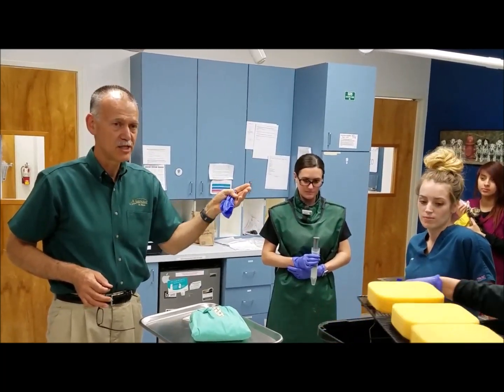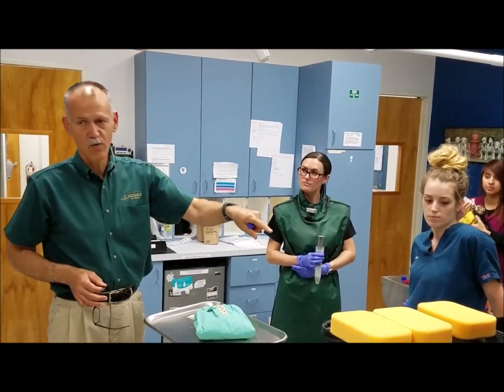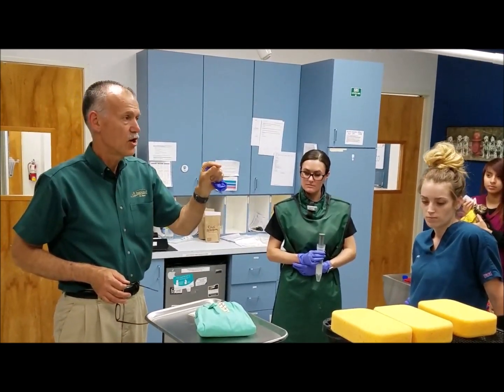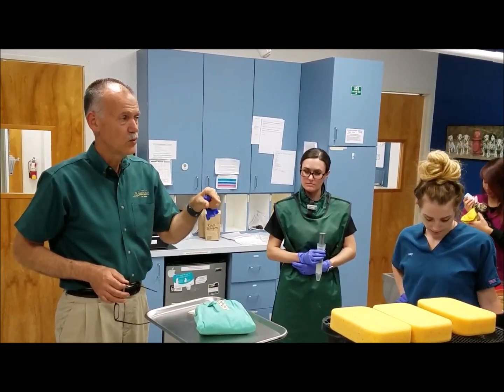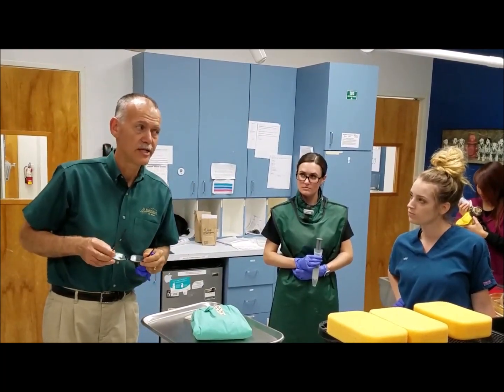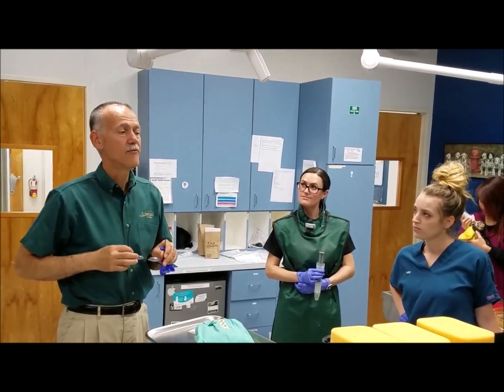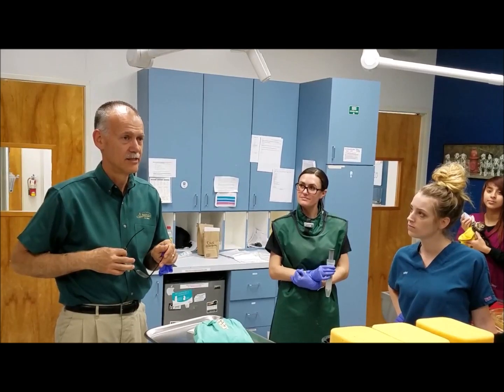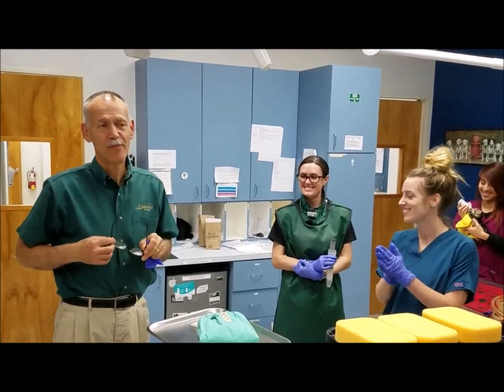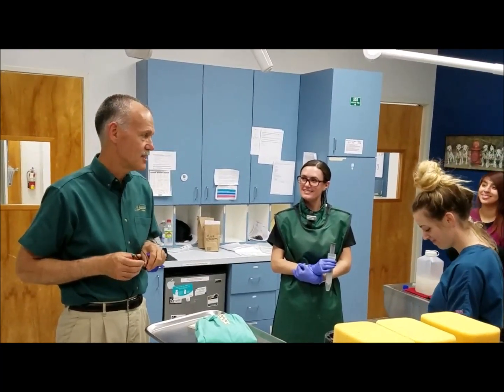We're spiking the water with oxygen because we have oxygen — why not? If his depth of anesthesia is too deep, we're going to reduce the amount of anesthetic water with non-anesthetic tank water. If his respiratory rate is too low when we've switched to full tank water with no anesthesia, we're going to stimulate his respiration with Dopram, which we've already got the math calculated. If he's in cardiac arrest, we're going to give epinephrine — we have the math calculated — not expecting any problems, but the best anesthesia is the well-prepared anesthesia.